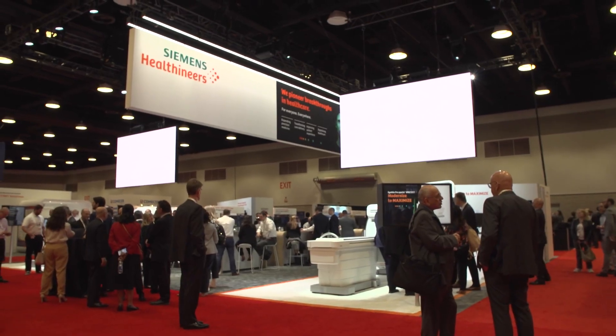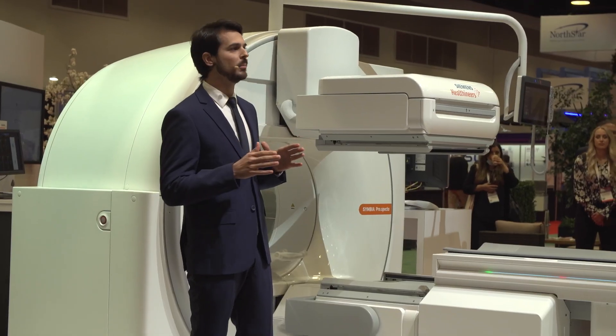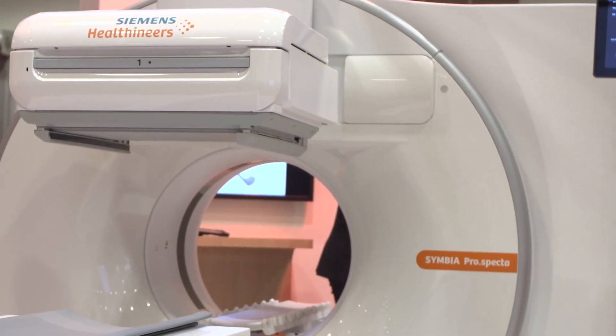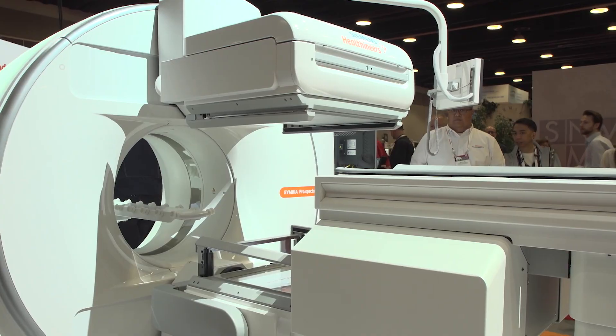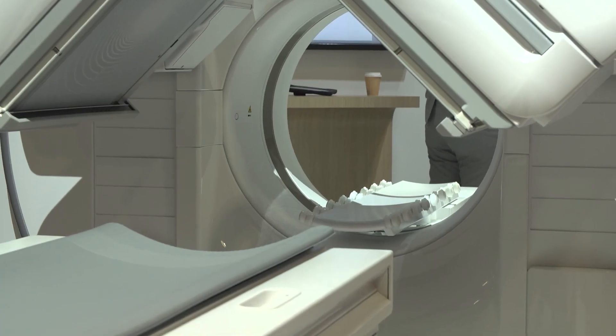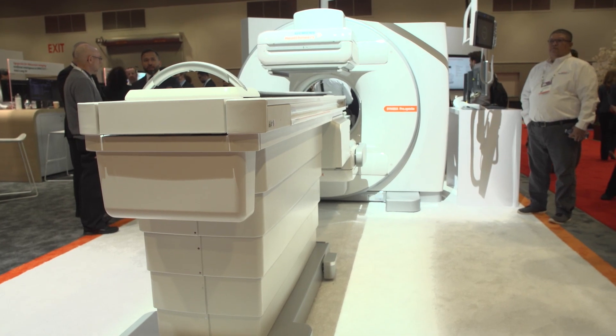At this year's SNMMI, we're super excited to pioneer another breakthrough in healthcare with the introduction of our new Symbia Prospecta SPECT CT. It has been designed with the user in mind and will set a new performance standard for SPECT CTs. Advanced features include automated motion correction, automated respiratory correction, automated retrospective gating, and a continuous scanning mode which allows you to reduce scan time and increase image quality at the same time.